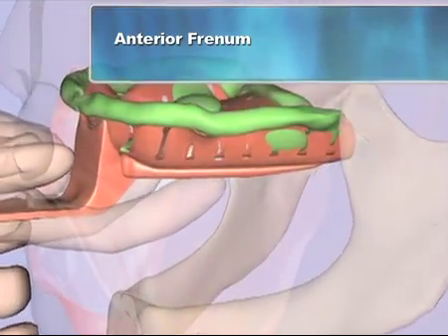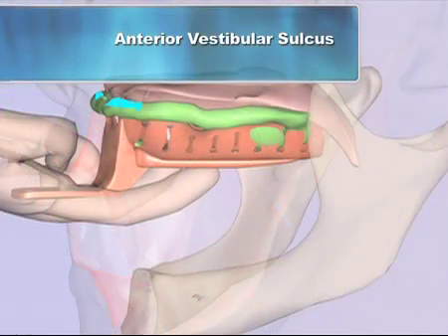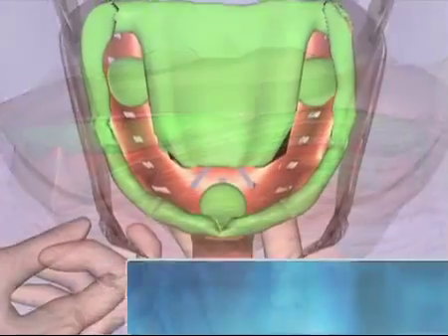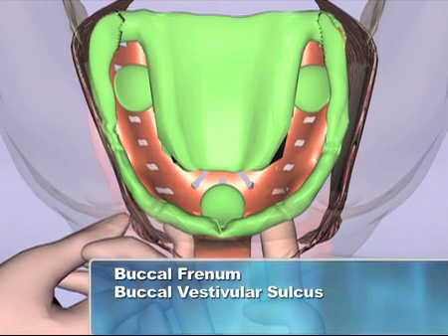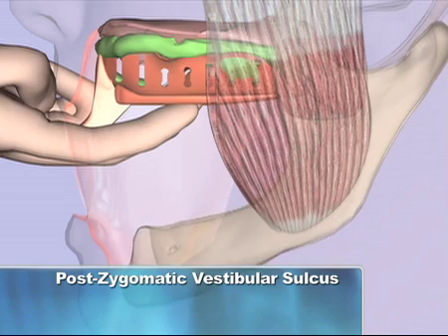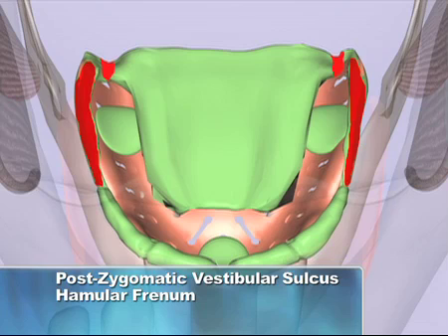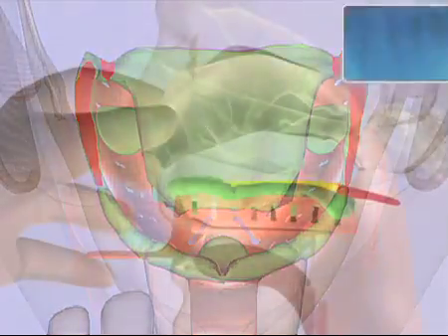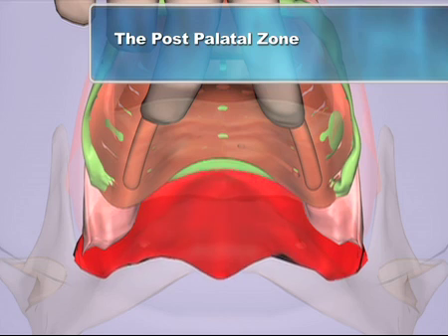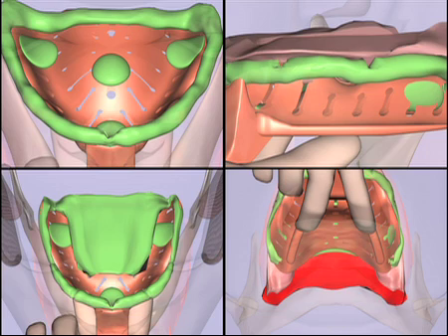Anterior frenum. Anterior vestibular sulcus. Buccal frenum and buccal vestibular sulcus. Post-zygomatic vestibular sulcus and hamular frenum. And finally, the post-palatal zone. Each of these areas is critical to obtain an optimal denture fit.